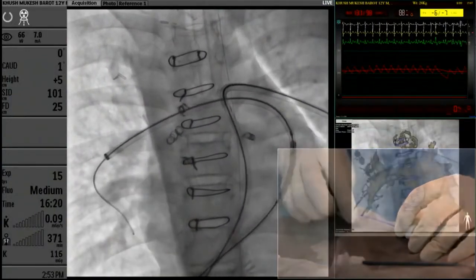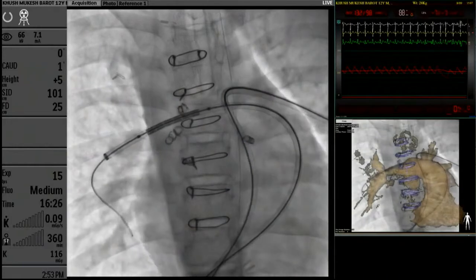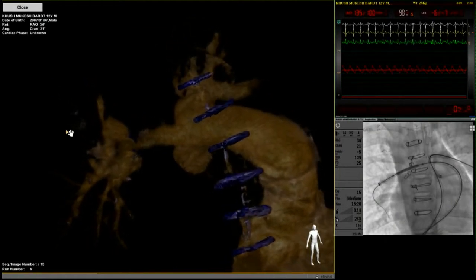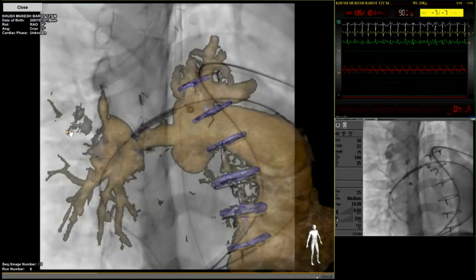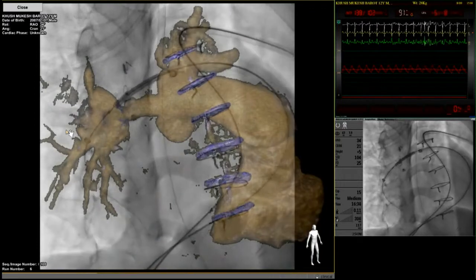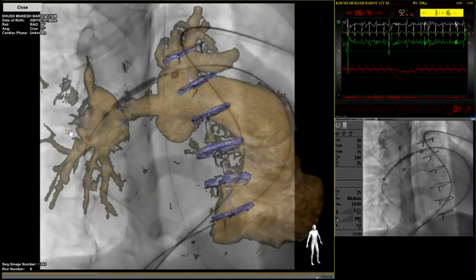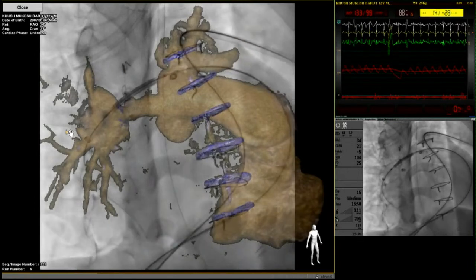Now give me the overlay now. So right now that marker is my landmark. Go to that same view, that RAO cranial, the same view. You see, now this is how it comes. So when the fluoro, the table is rotating, automatically the entire right pulmonary artery rotates and it comes to the view that we want. Connect it to the indiflator system. So that marker was my guiding point. The clip on to the right upper lobe pulmonary artery was the, you are ready?